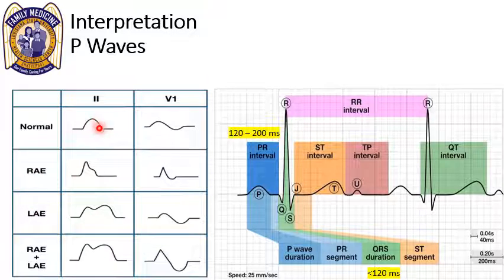It's also going to be present in front of every QRS complex. Now, you can quickly ascertain whether or not something is going on if there's an absence of P waves or they appear fibrillatory, and that would assist you in the diagnosis of AFib, A-flutter, and other abnormalities that can be seen on a 12 lead when it comes to atrial pathology.